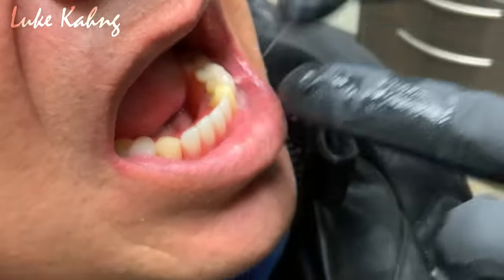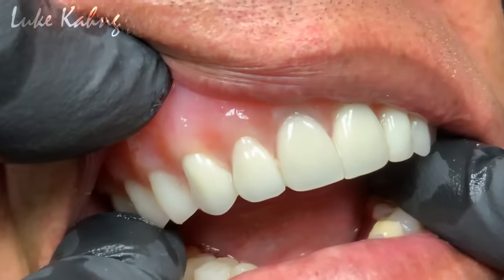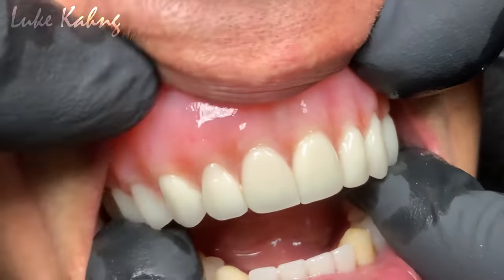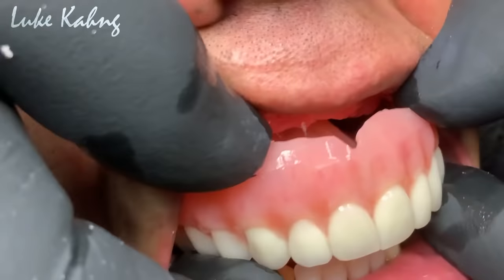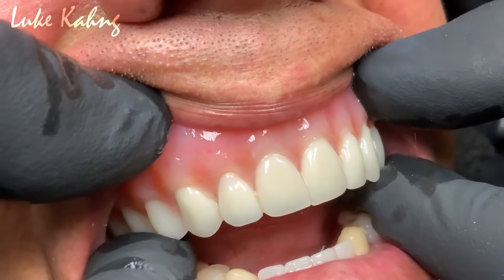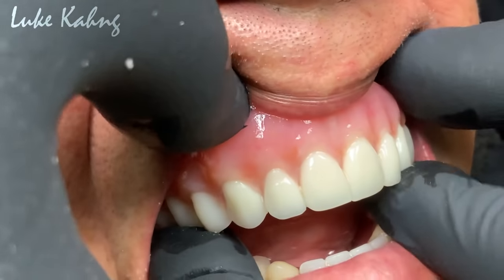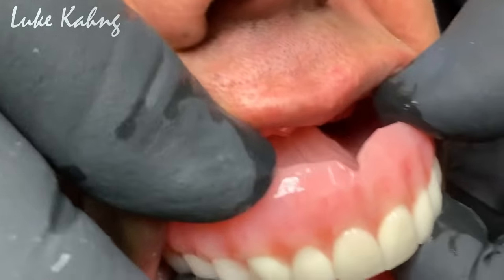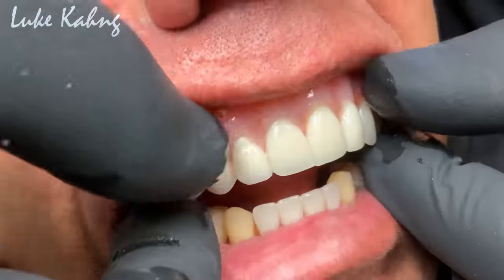Okay, it's good. Nice. So you hear that right there? Here, listen. You hear that? That's the sound you want. Okay? Here it is again. This is the sound you're looking for. That's the sound you're looking for. Okay? And you want to struggle to get that.